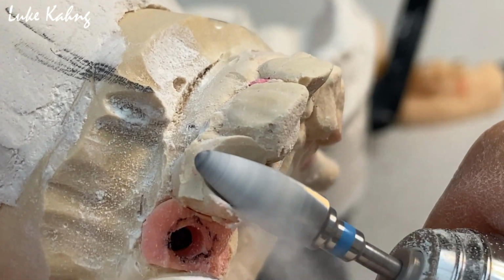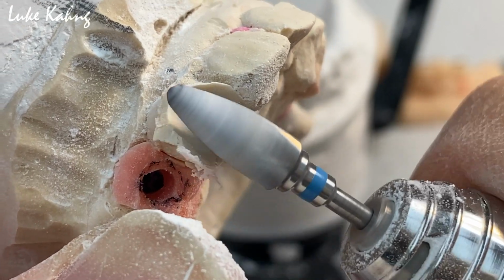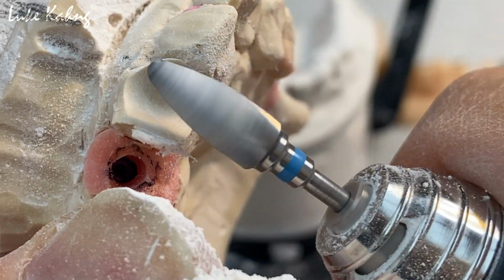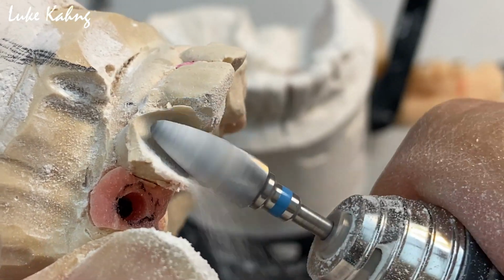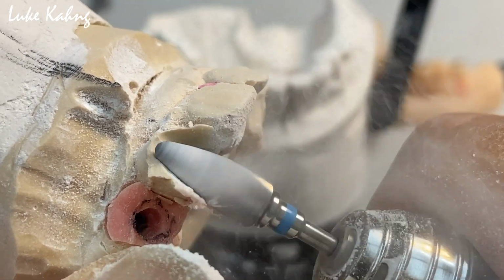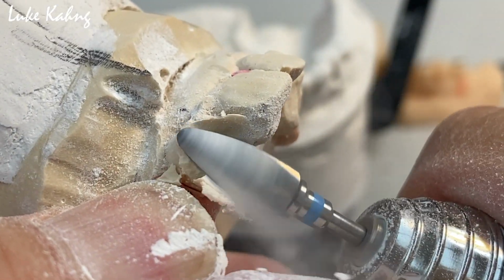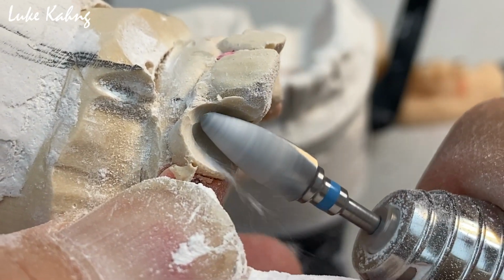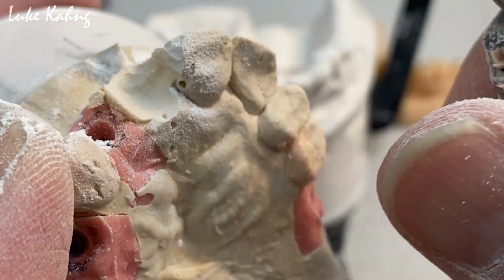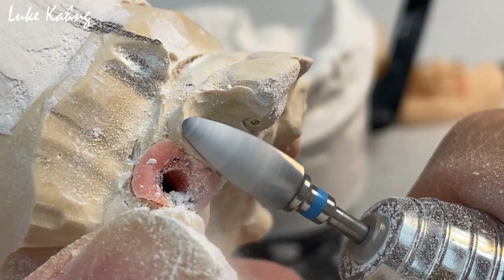Trying to make the convex. Maintain the principal contour, but reduce it like a football shape.